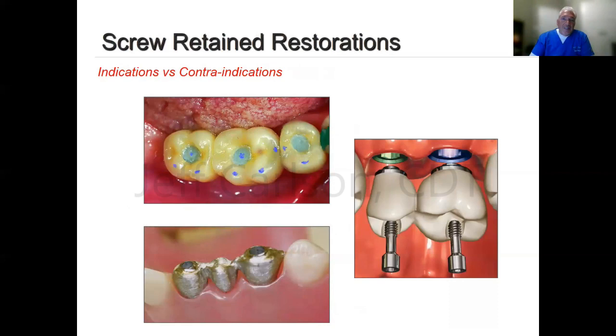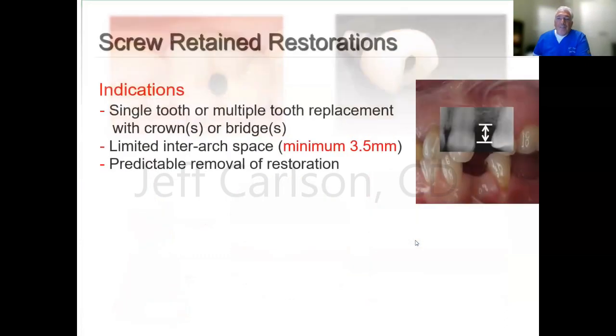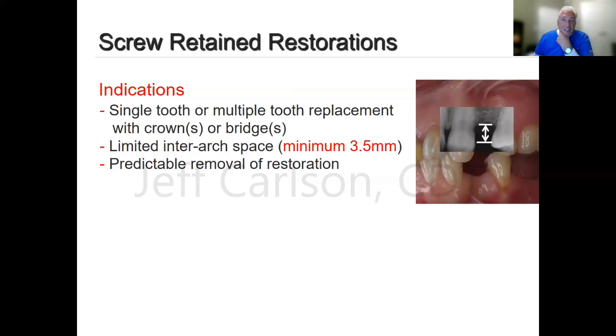So let's take a quick look at some screw retained indications, contraindications. Typically, with your screw retained, the abutment is separate from the crown, but the laboratory would typically do some type of cementation to that. Milling nowadays, we can mill pieces, but you're still going to have the hole through that, where the screw is going to engage the connection of the abutment into the implant. The screw is actually going through the crown, through the abutment, and engaging the internal threads of the implant. And to the degree you can mask that occlusal access hole for aesthetics, you meet the patient's aesthetic expectations.